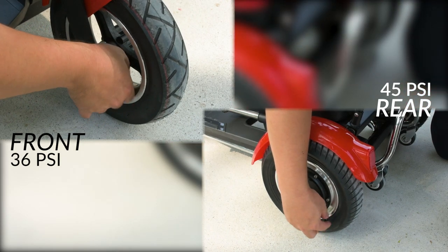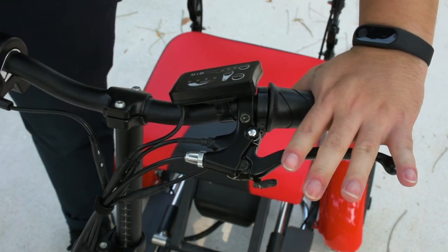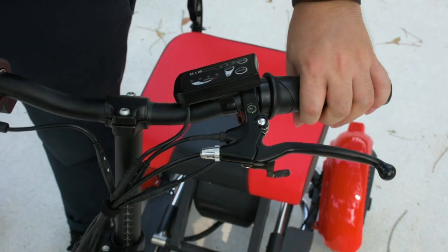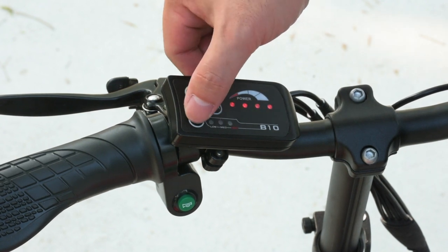When using the brake, there is a locking mechanism that can hold it in place. This prevents the Flexi Pro from rolling away. Hold down the brake again and release to disengage the lock.